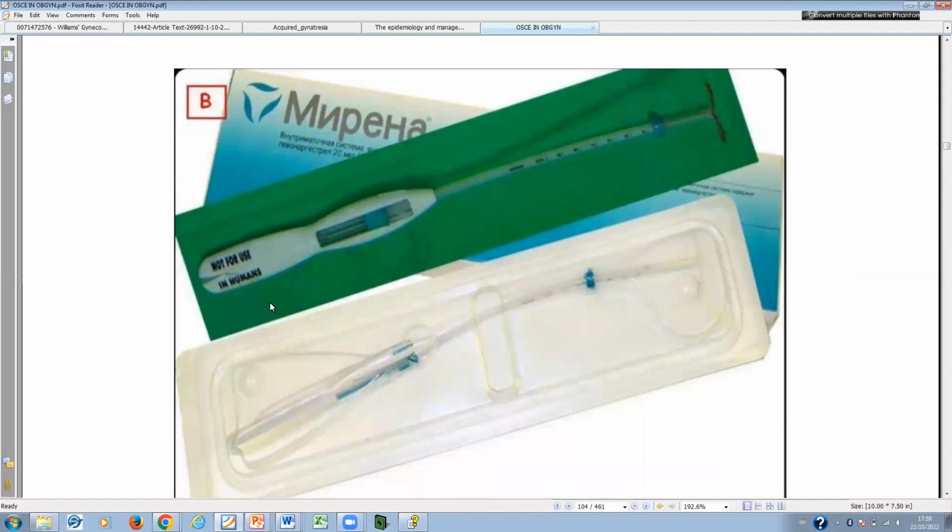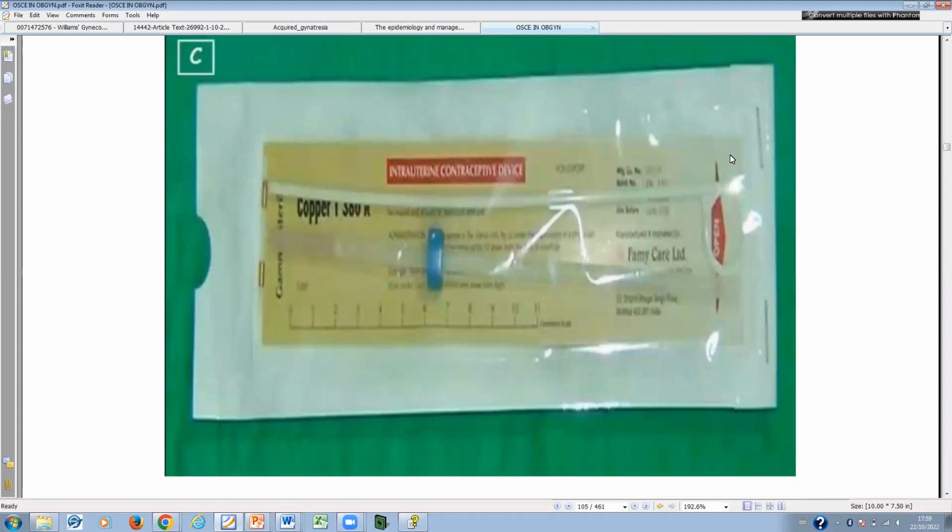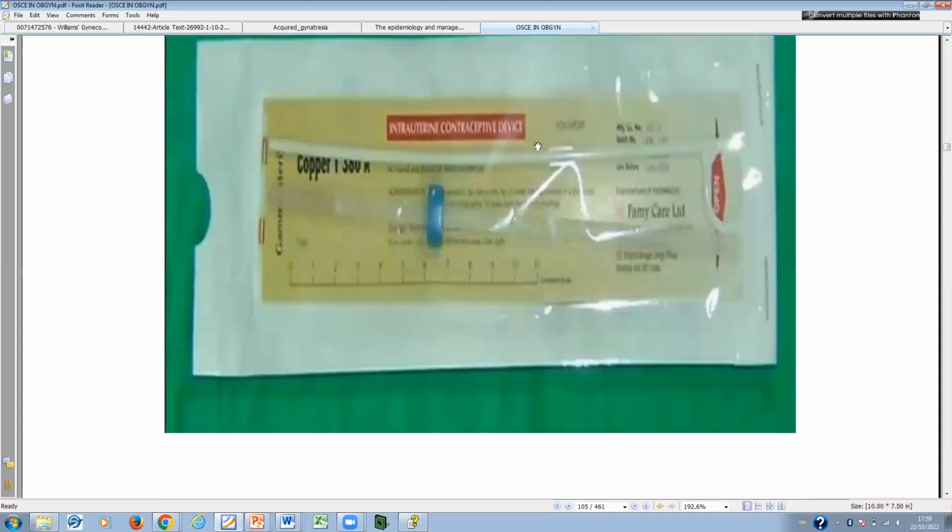This is the copper T. You could see the copper T, and this is the loader. After correct insertion, this plunger is pulled out while the T end is retained in the uterine cavity. So this is the copper T. This is another copper T inside. If you look at the end here, you see a brown structure. This is the T end, while this is the plunger, and this is the blue flange.